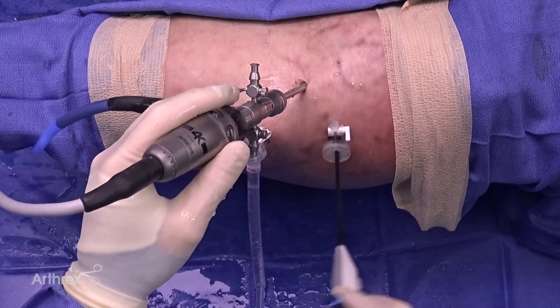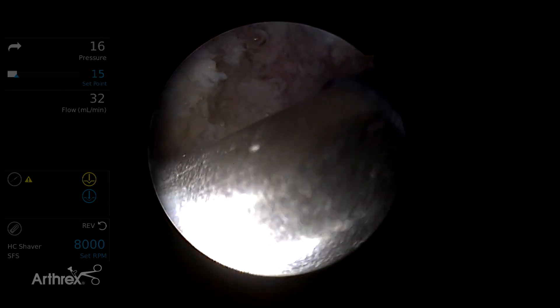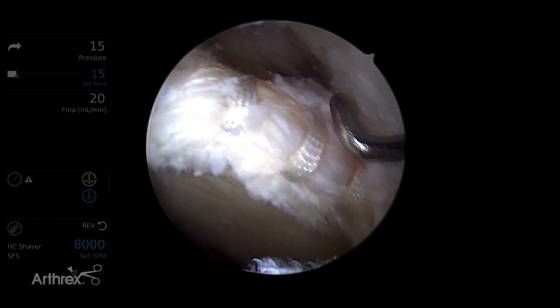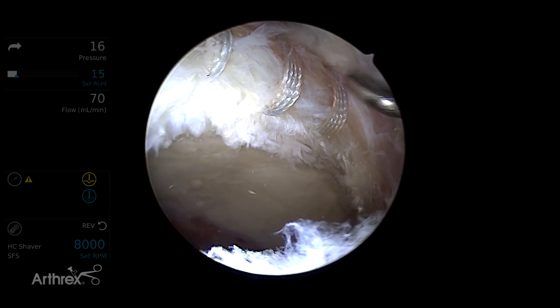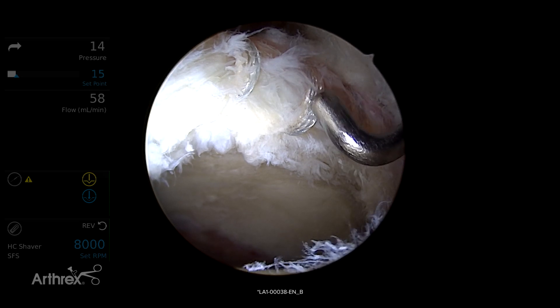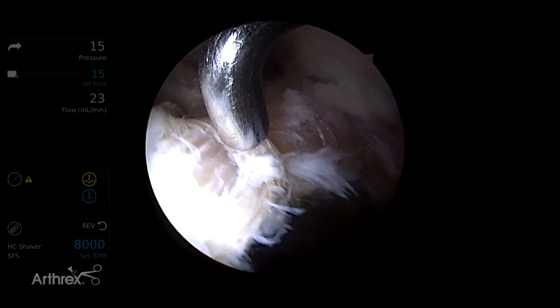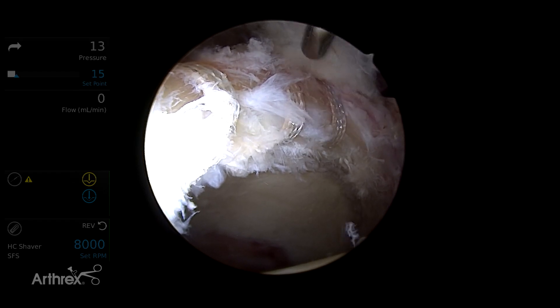This completes the final labral repair. You can see the position of the 3 o'clock anchor, the over-the-top position, with adequate bone stock between the hole and the psoas recess — ensuring no psoas irritation, as we confirmed that position previously. Restoration of the chondrolabral junction is confirmed. I prefer a circumferential labral repair because you get more labral tissue within your repair, it minimizes potential pullout of the suture, and with the tensioning capabilities of the push lock, labral eversion is very hard to achieve. As a result, the suction seal is always restored, even without a labral base stitch, and more labral tissue is incorporated, strengthening the repair.